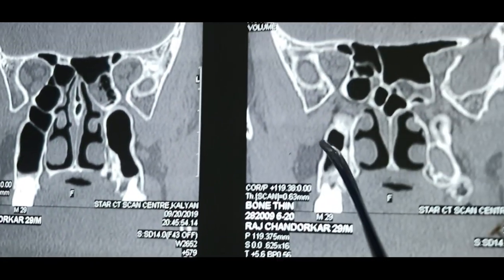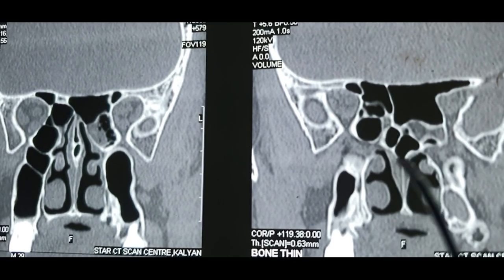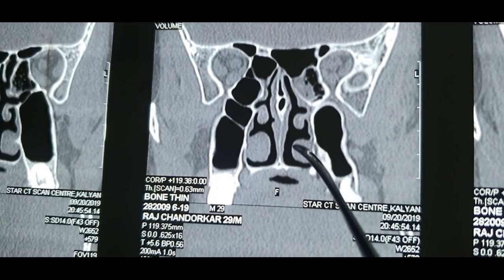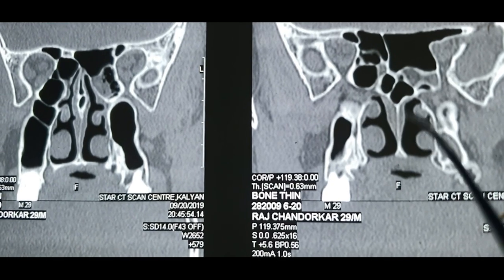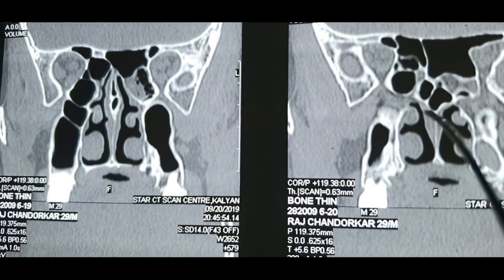As soon as you go in the one scan behind 0.6 mm, you see this? This is the nasal cavity here at this level. And this is called the choana. This was the posterior-most nasal cavity, and this is a choana now. And this is the sphenoid sinus proper, and this is the choana. And see the septum, it's only till here at the level of the choana.